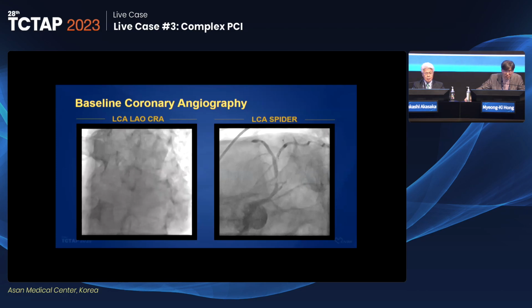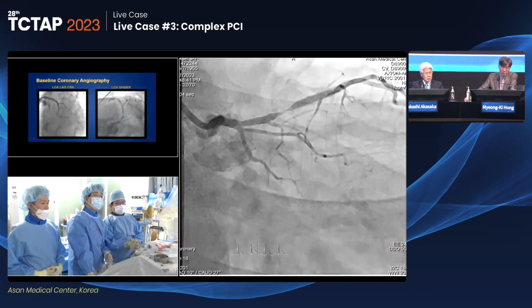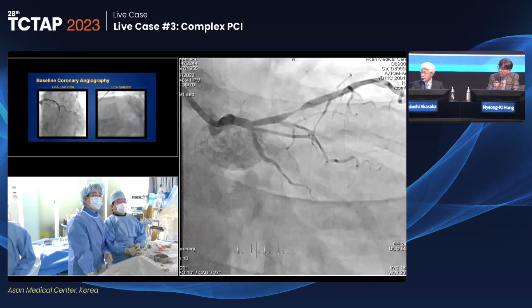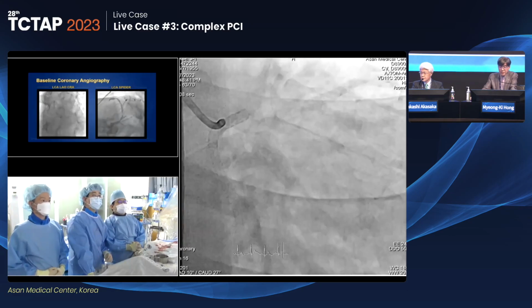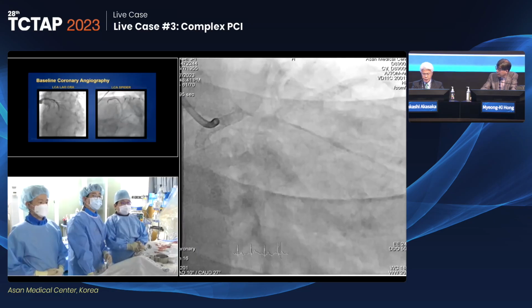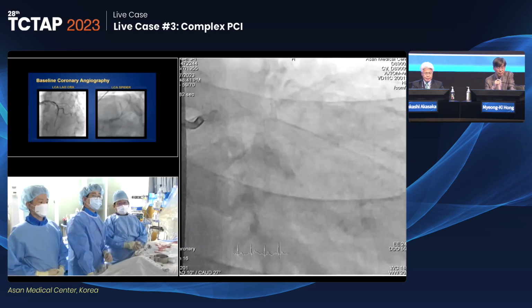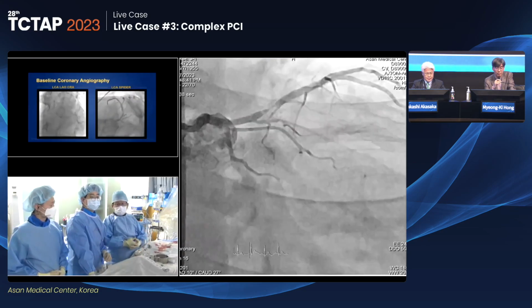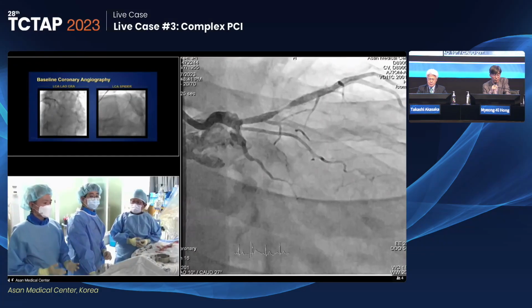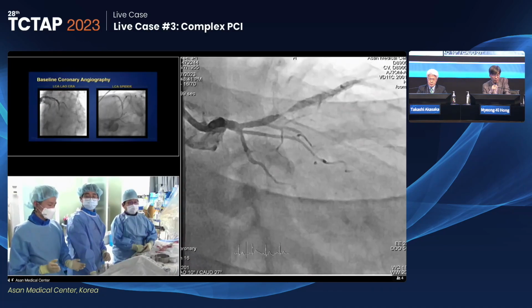Thank you, Dr. Jo. Do you have any comment or question on patient history and baseline coronary angiogram? Any comment from the panelists? When were the stents placed? I may have missed it. 2 years ago? Yeah, 2 years ago. Right. So Dr. Jo, after the PCI 2 years ago, the patient didn't have any effort chest pain. His effort chest pain started 3 months ago.